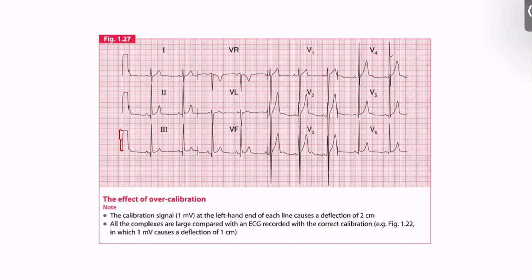Okay, so the first thing is how to calculate the heart rate. Heart rate calculation.